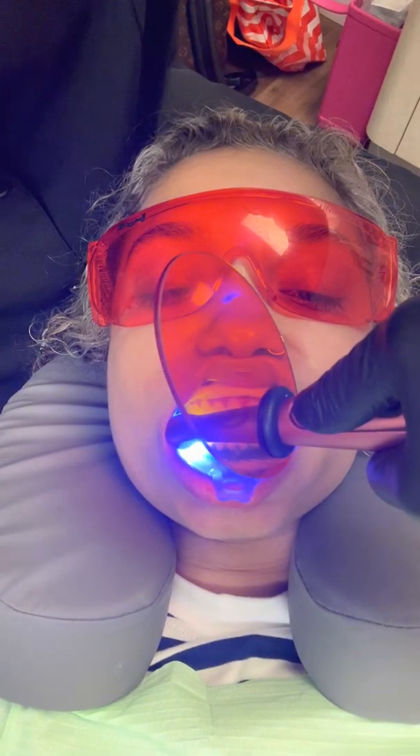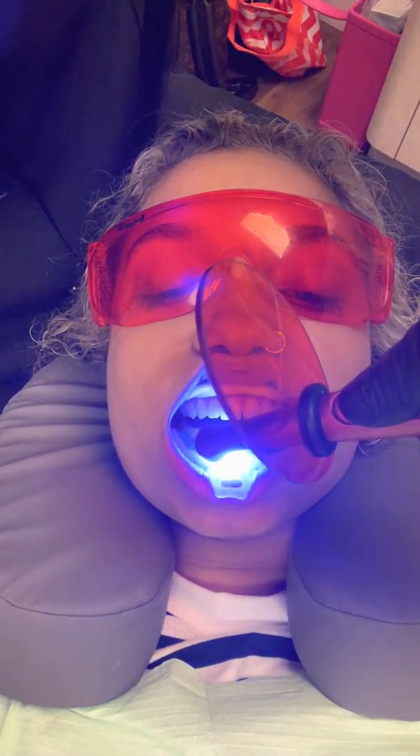Remind yourself that a lot of times I see assistants trying to really minimize where the gingival barrier is at the gum. I will say that anywhere that the bleach is going to touch the teeth it will go in, so you don't really have to worry if you've got a little bit of that barrier close to the gum line. She's got a lot of teeth for me to bleach, so I'm not worried. What I was worried about is the fact that that bleach is going to seep through.